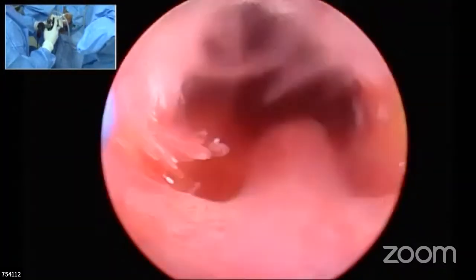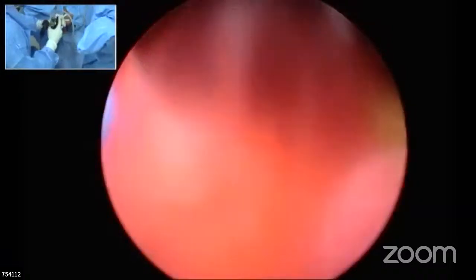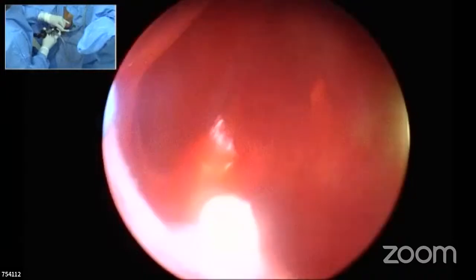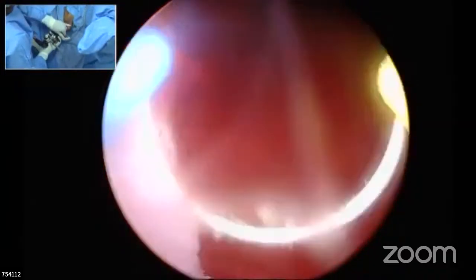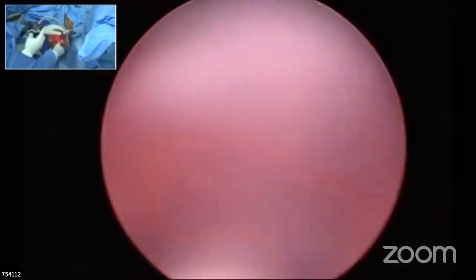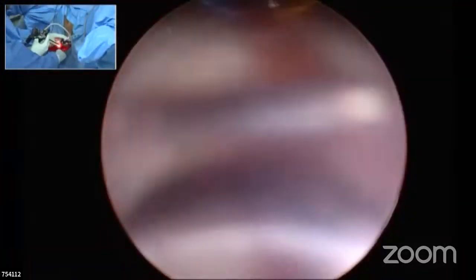But there will be some amount of apical tissue when you rescope them. See, this is the verumontanum, and this is the preservation of the thing that I wanted to have. I'll empty and I'll show you. You have done the apex very well on both sides. Absolutely good.